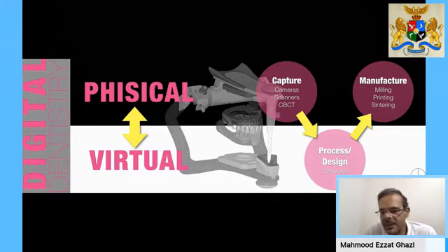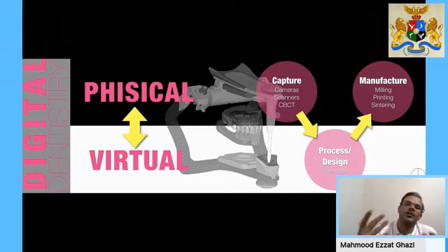The second step in digital dentistry is where we start to process all this information. All this information is brought into your laptop, and we register them on top of each other, meaning that the face is in one position, and then the teeth and the gums are in the same position as they are on the face. And then we bring the CBCT in that same position again, and we call this registration. And this is where we can see everything in 3D in layers. And then we start to design where we want to place our implants, let's say, or where we want to do our wax up according to the patient's face. And we'll take an overview.